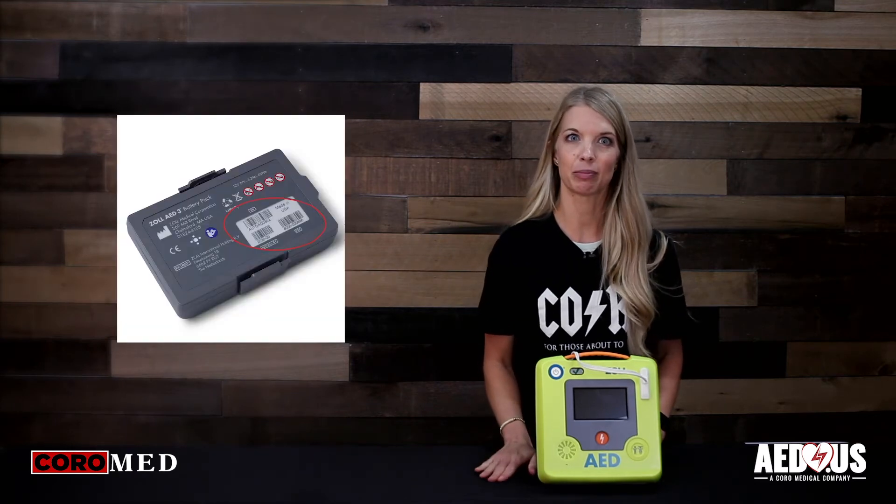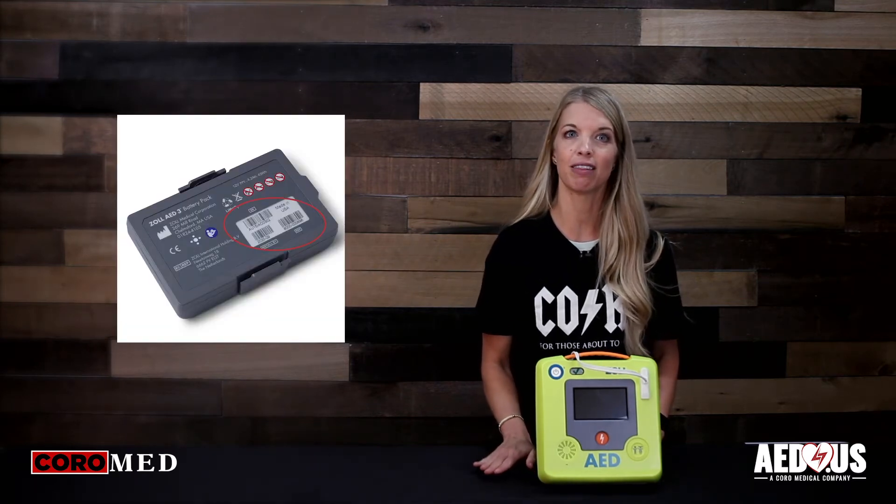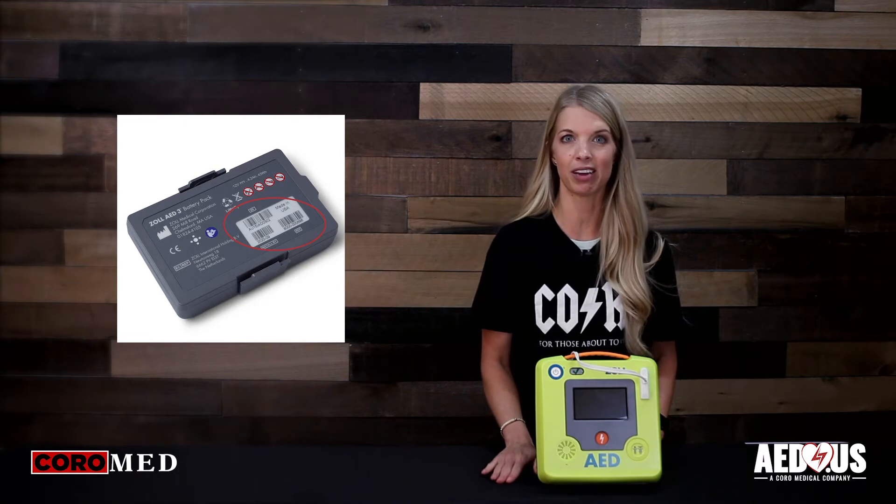Now the battery has a five-year expiration. The manufacture date and the use-by date are both listed on the outside of the battery. To install or replace the battery, verify the defibrillator is turned off.